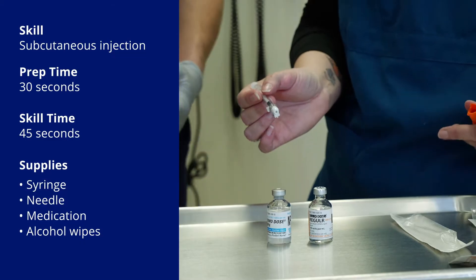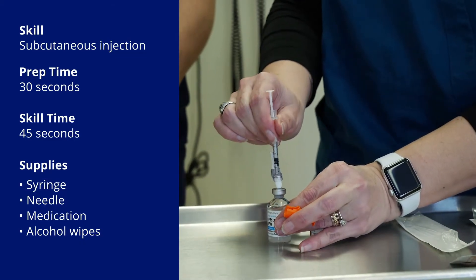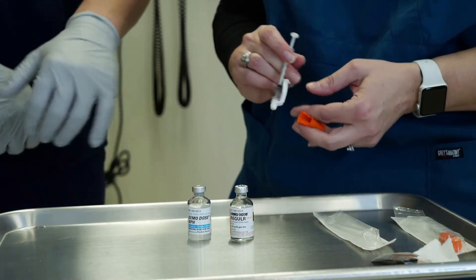We're going to put air into the cloudy one first, but do not flip it over — we're throwing air in first. Then we're pulling it out and throwing air into the regular.